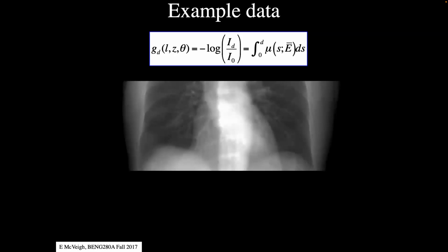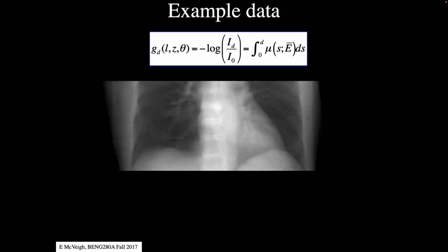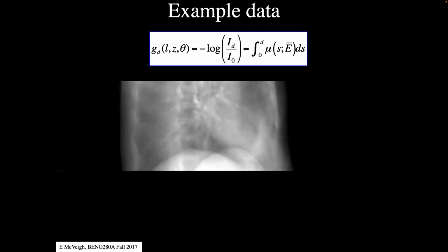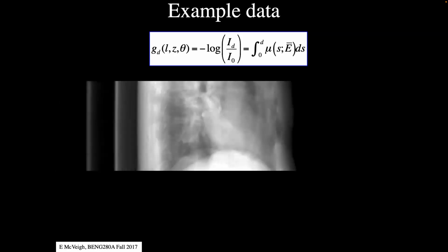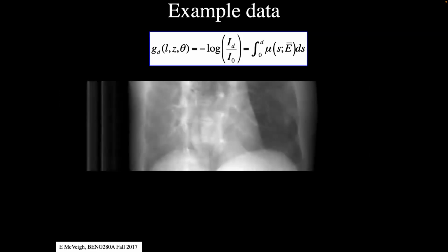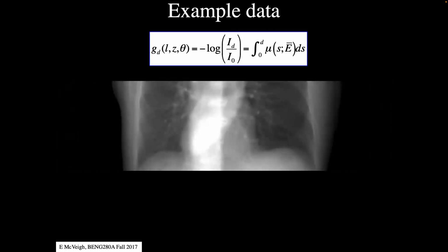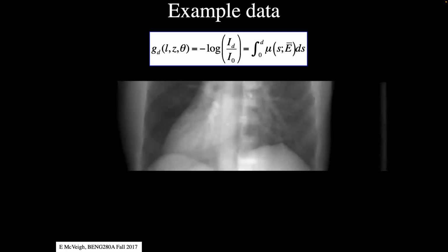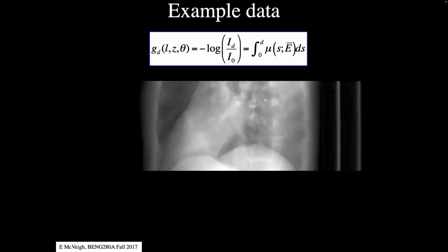So it's a fairly high rate of data acquisition and transfer. The entire raw data set for something that we're looking at here is about 2 gigabytes of data. Okay? And so it's not outrageous.